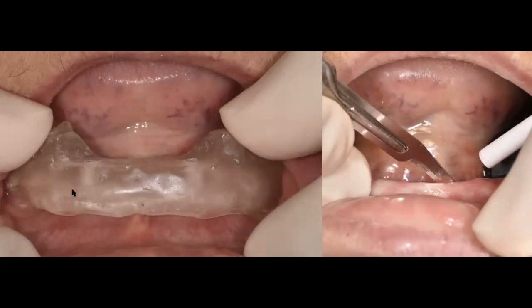So now you can see the denture is fully seated. It's going to sit in the patient's mouth because this denture is a duplicate of the actual denture the patient was wearing. So we know it's going to fully sit in the patient's mouth. So we just want to make sure that we try it in and it fully sits. And once we do that, we can go ahead and fabricate what I call bleeding points. And this is something that I always do and teach how to do before we flap this patient. So we place our guide. We use a lancet type of blade, a drill, and we go in with that lancet drill and we just create some bleeding points directly onto the tissue. You can even go a couple of millimeters within the bone.